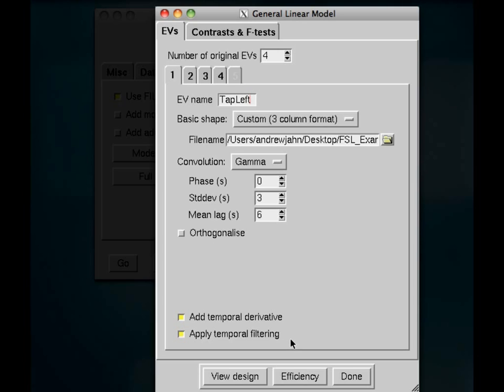So add temporal derivative and apply temporal filtering. Those are both fine. A temporal derivative will attempt to account for any shifts or lags in the onset of the BOLD response. And applying temporal filtering will apply that high-pass filter we specified previously in the last tutorial.